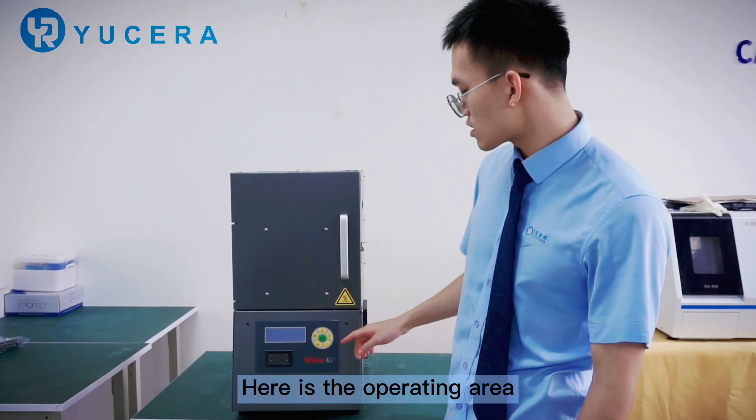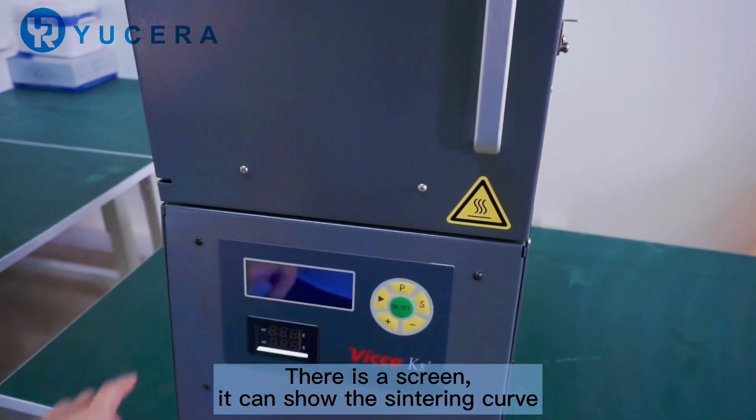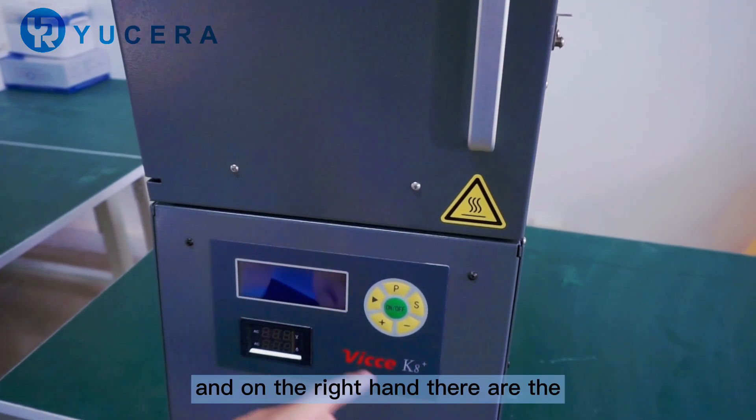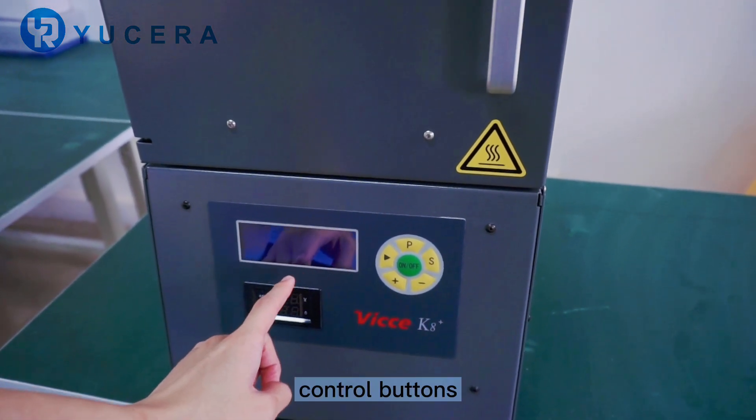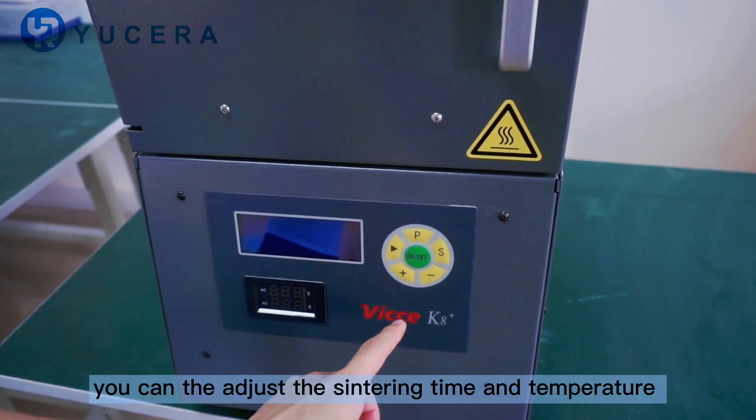Here is the operating area. There is a screen that can show the sintering curve, and on the right hand there are the control buttons. You can adjust the sintering time and the temperature.